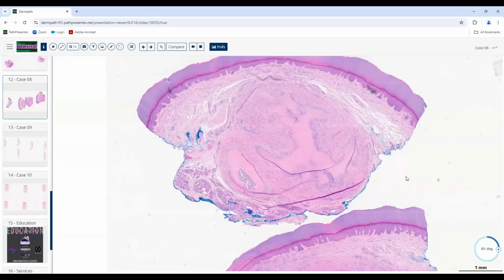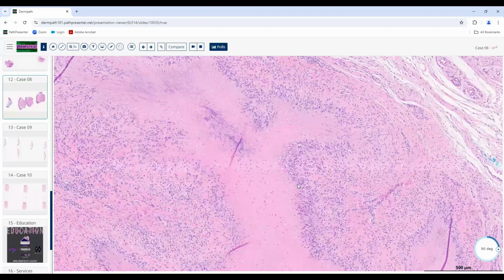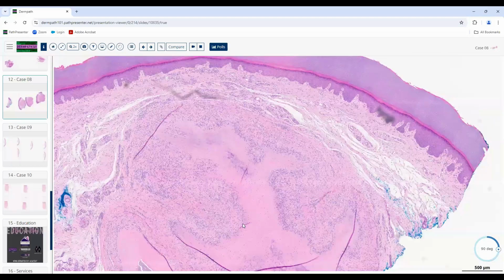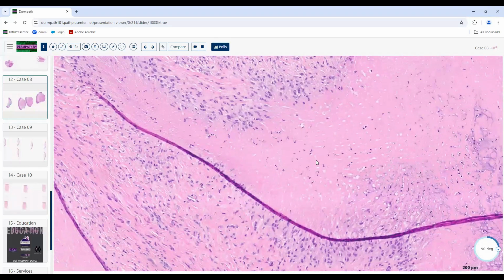I felt like with this one you could tell the location because of the thick stratum corneum and the prominent granular layer. So it seems like an acral location. And then we have a non-epithelial neoplasm on higher magnification. I was leaning fibrohistiocytic. Overall, it's a small, well circumscribed and symmetrical lesion. There's pink fibrin, histiocytes, and then I felt like some of the cells were palisading or spindled.